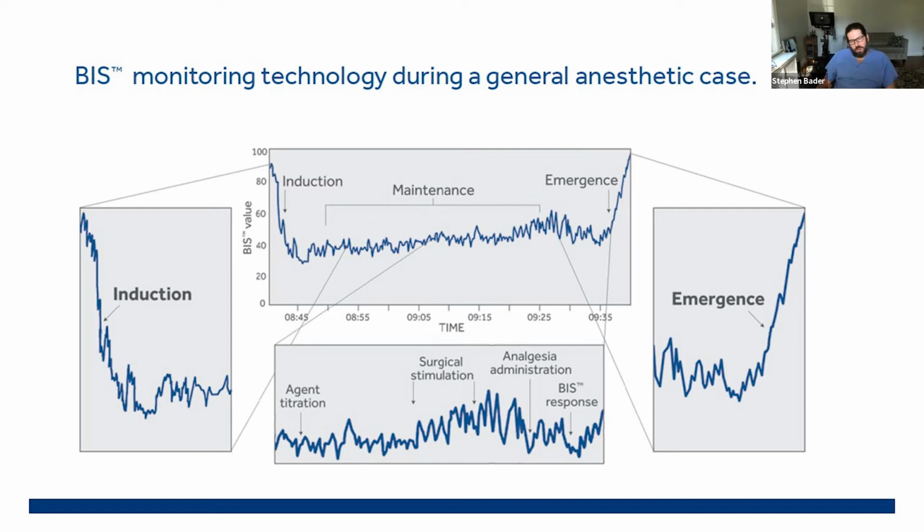So most of us are really pretty comfortable with managing the maintenance phase and with using the BIS as a helpful monitor during that time. But I think it's kind of overlooked that you can also get a lot of value out of it during induction.